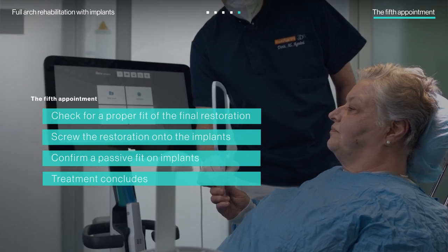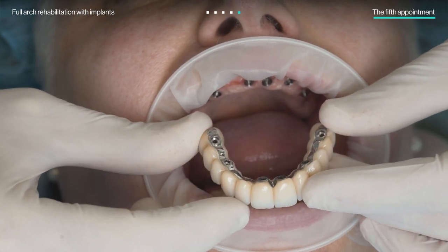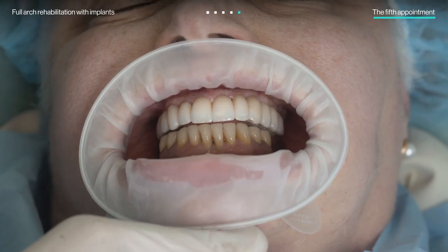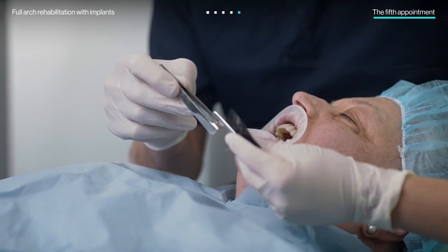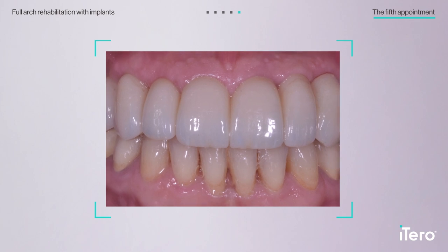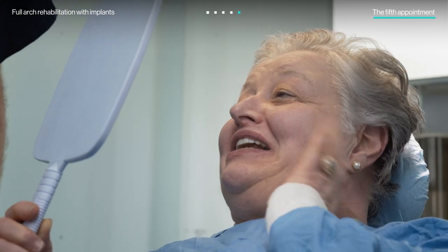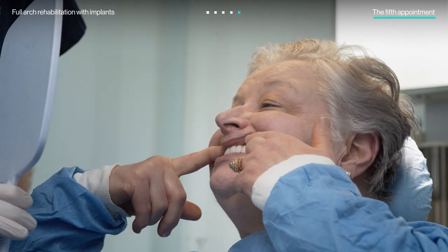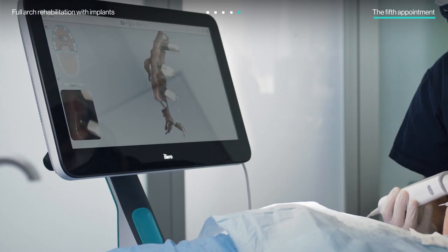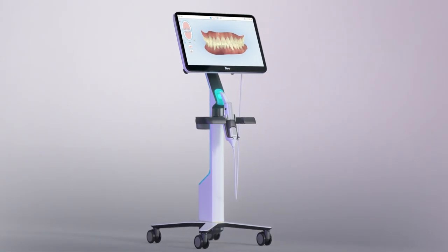At the final appointment, the doctors checked with the patient to ensure everything felt right before screwing the restoration onto the implants. In addition to checking for balanced occlusion and proper function and aesthetics, they made sure the implants had an accurate passive fit and the soft tissue wasn't compressed by the restoration. After confirming patient satisfaction, the full-arch rehabilitation with implants was completed and routine care and monitoring were resumed. And that's just one example of how the iTero scanner is a versatile tool designed to help you simplify complex treatments, work seamlessly with your lab, and increase patient satisfaction.